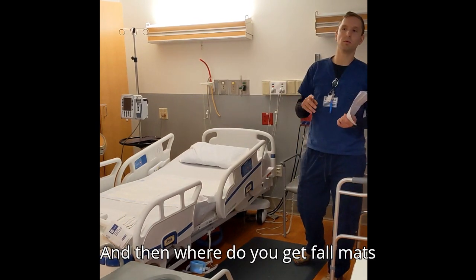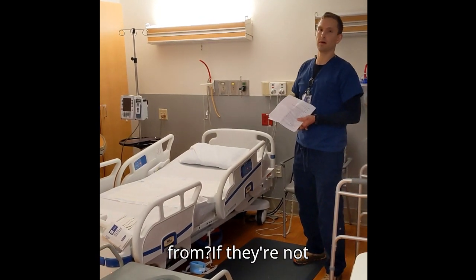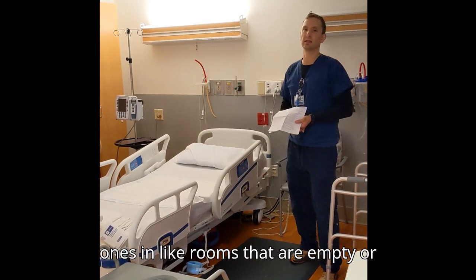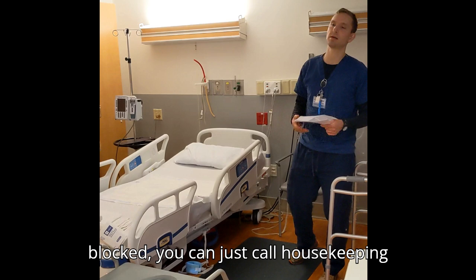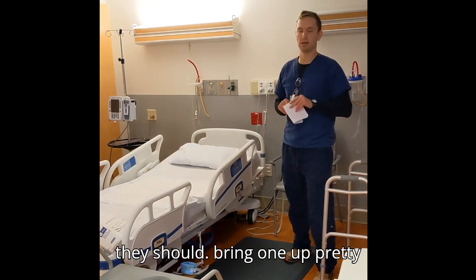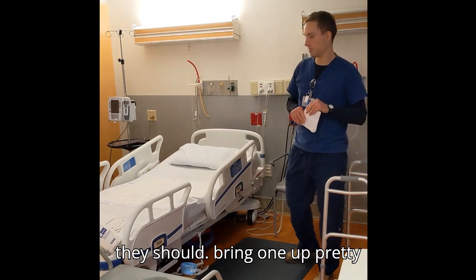And then where do you get fall mats from? If they're not in the room or we don't have any extra ones in empty or blocked rooms, you can just call housekeeping, ask them to bring one up, and they should bring one up pretty quickly.